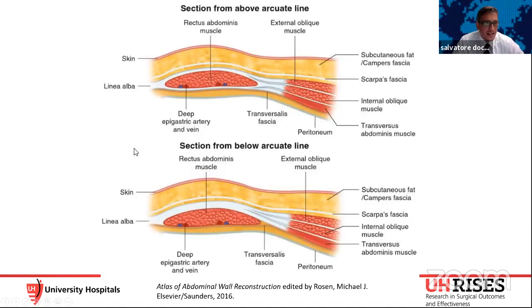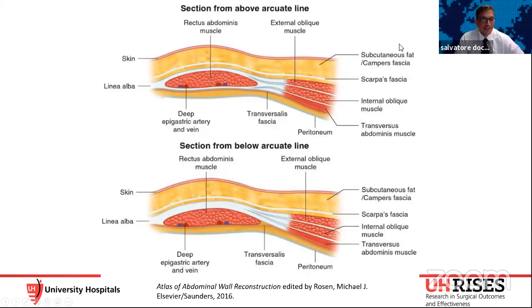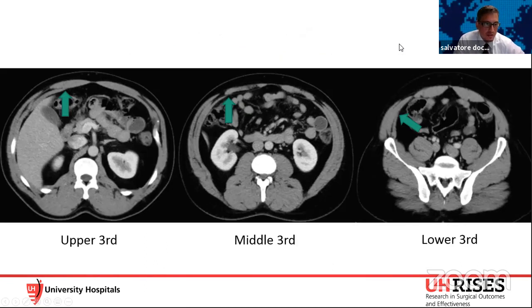That's a fantastic slide, by the way. Yeah, well, I thank the ED for getting the images. Well, I think it talks to the point that when you're starting out, especially doing TARS, they always teach you, when you're doing top down, to start higher up where the muscles may be thicker, more medial. So I think by showing it there radiographically, you have almost a good landmark in terms of what to aim for in your preoperative planning. Yeah, absolutely. And then once you get familiar with getting in these planes, it becomes much easier. Yep.